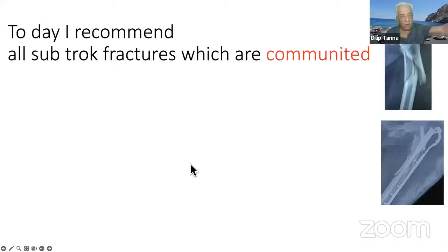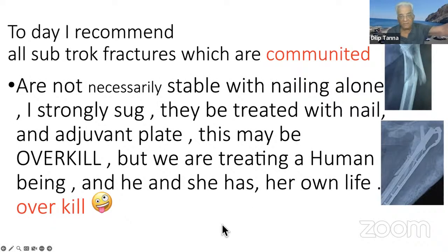Today, I recommend all subtrochanteric fractures which are comminuted like this are not necessarily stable with nailing alone. I strongly suggest they be treated with the nail and adjuvant plate or a cerclage. This may be an overkill, but we are taking a human being and he or she has to have her own life. So overkill is not a sin.